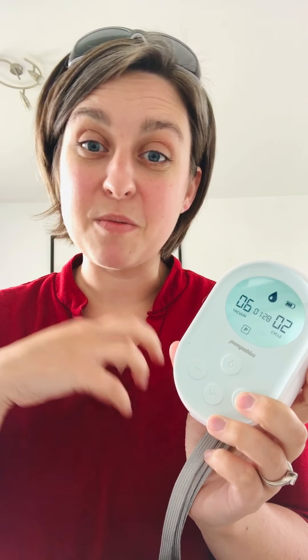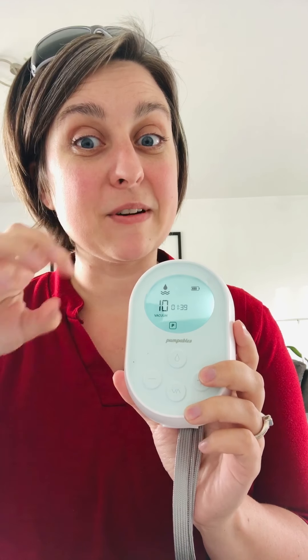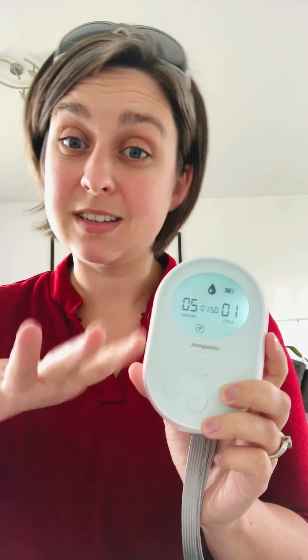On expression mode, the cycle settings refer to cycles per minute. In stimulation mode, there are a lot more cycles per minute — it's faster, similar to what a baby does. Then when you switch over into expression mode, you can go faster or lower — it's a slower cycle speed overall.